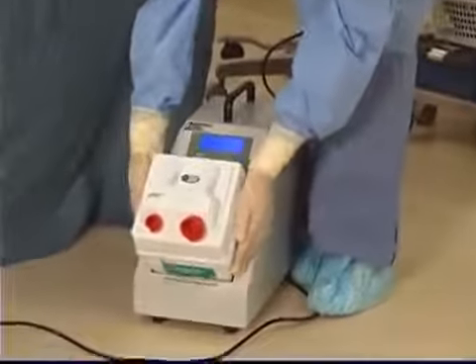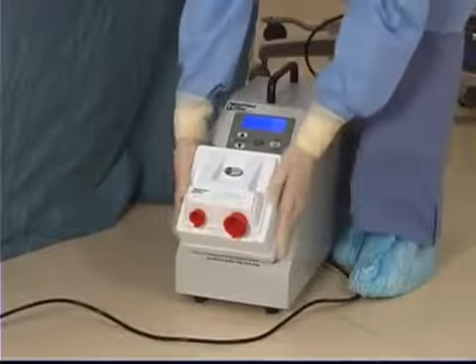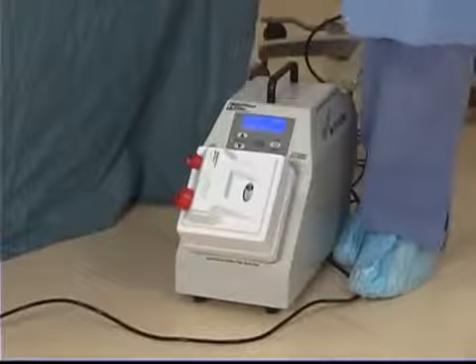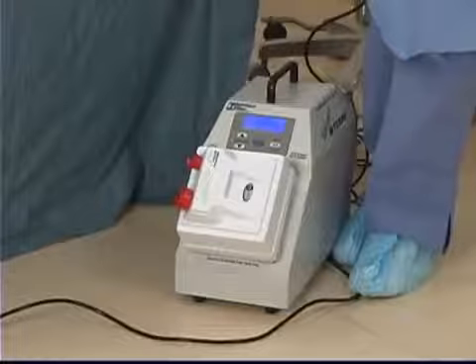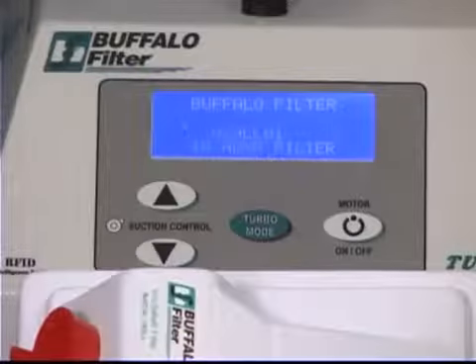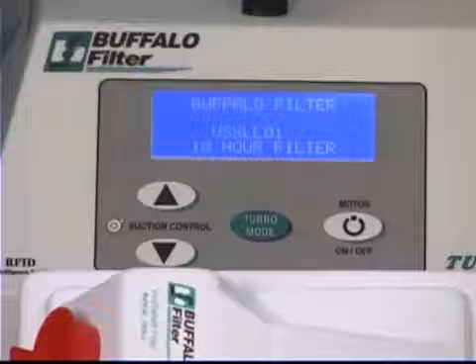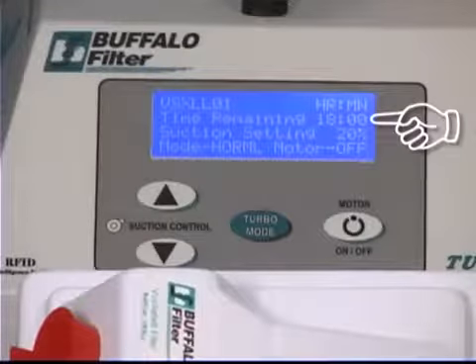Place your ViroSafe filter into the filter basket of the Whisper Turbo AutoSense unit. The filter may be placed into the unit facing any direction. Face the hose opening in the direction that best suits your operating needs. If the Whisper Turbo AutoSense is already turned on, the turbo unit will recognize the ViroSafe filter, will indicate the model number, and will display the time remaining on the filter in 1-minute increments.